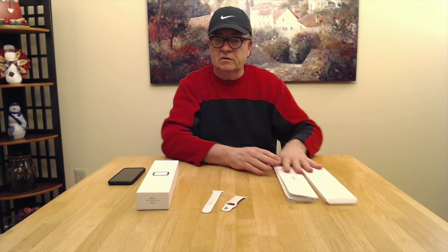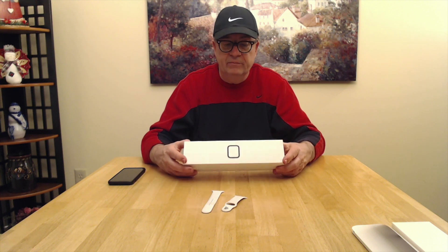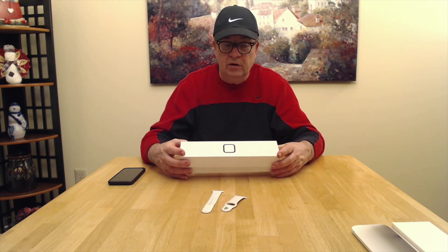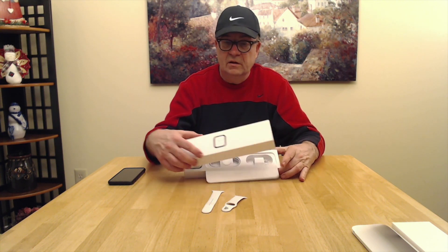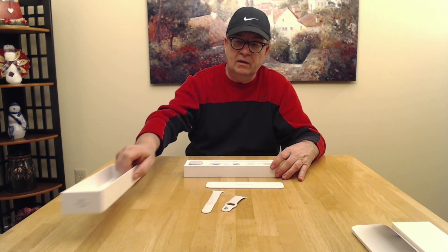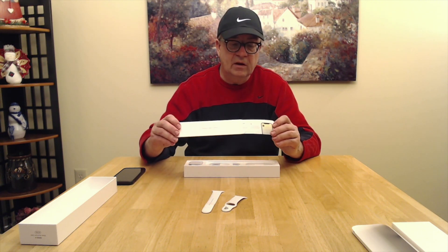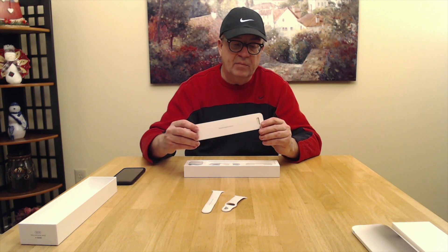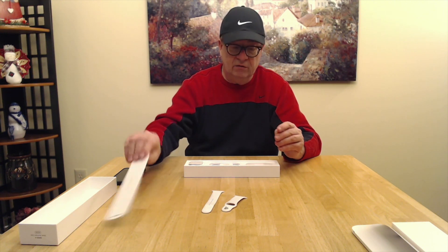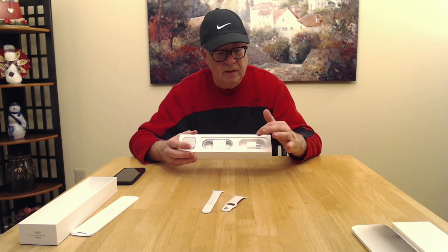All right, let's put this aside for a minute. Here is the main event — the Apple Watch Series 4, the 44mm size, the bigger one. It's a nice sturdy box. You get this little thing here with instructions and paraphernalia — we're going to put that right back in because the more you take it out the harder it is to get back.